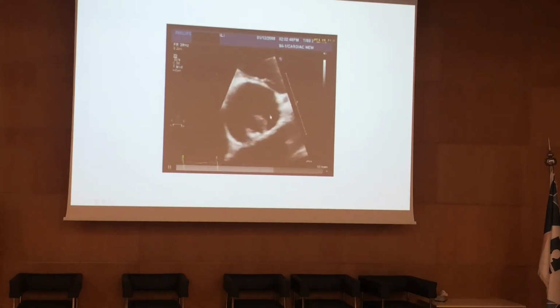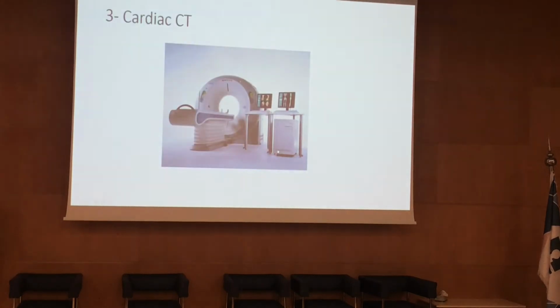So this is a bicuspid aortic valve. As we mentioned, it's assessment of the valves. So basically, echo is to assess the left ventricular function, right ventricular function, and atrial and ventricular size, as well as valves. These are the most important applications, along with pericardial effusion and ascending aorta.